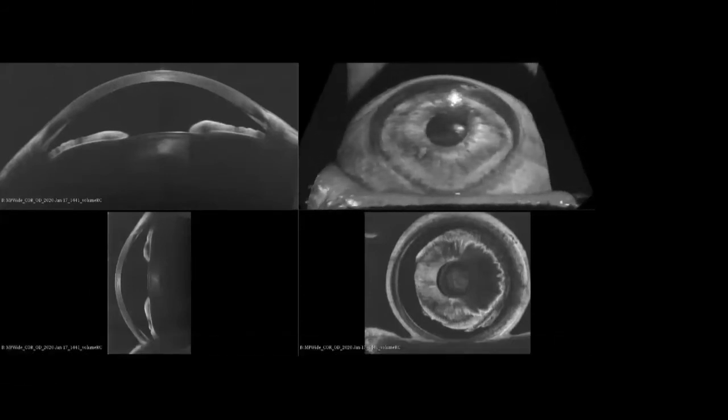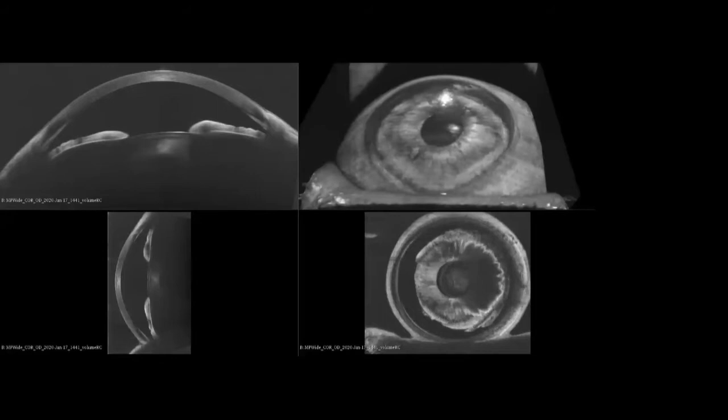And if you look just at the top of the eye, just above that bright spot on the right, there's a mark there. That's actually a problem with a LASIK surgery. The eye has grown back wrong, and it's actually causing some vision problems for this person. Now this is just rotating. You can see the incredible detail that we're getting there.